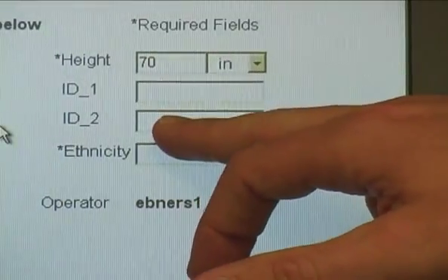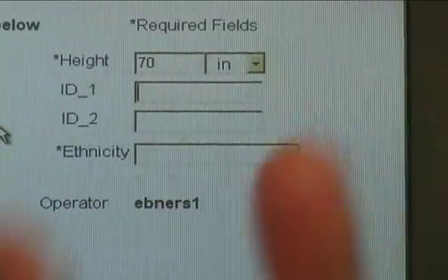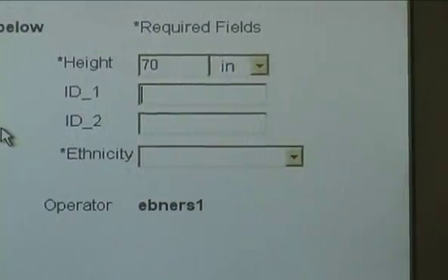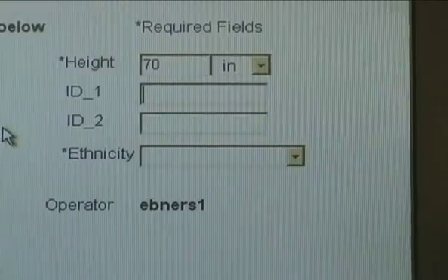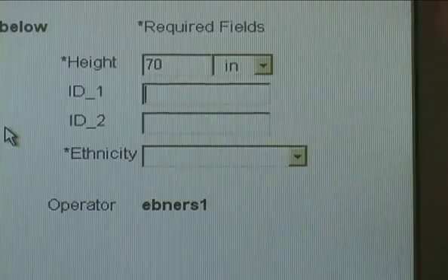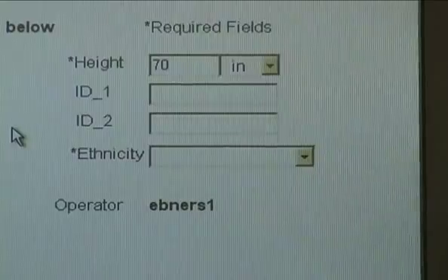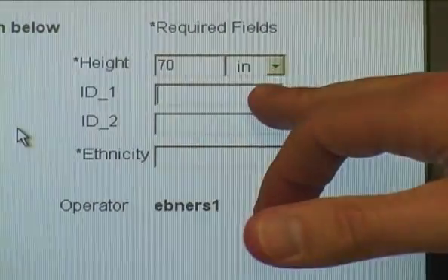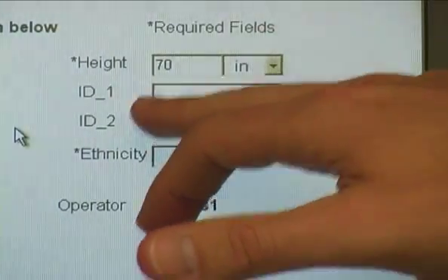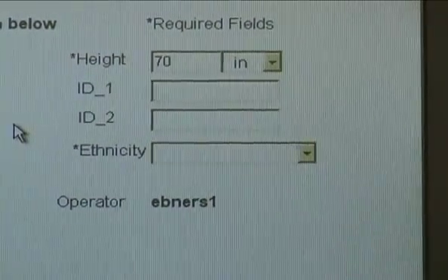So ID1 and ID2, as I mentioned, is to further delineate records. If you're testing athletics and you want to be able to segment when you export data, you test women's basketball, you could put women's basketball here, and then you could do a search for just those files and export just those. If you wanted Stacy's research, you could put Stacy's research, and let's say you have 2 research projects going on, children and elderly, you could put Stacy's research elderly, and it will only call up those records affiliated with that.